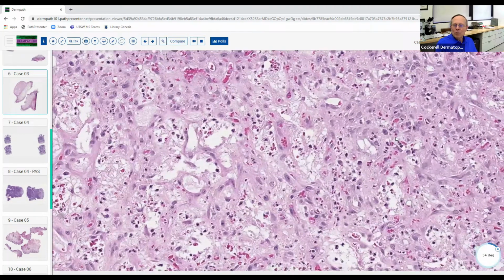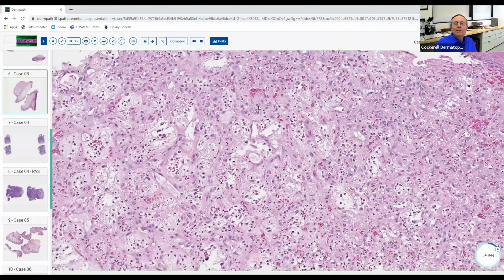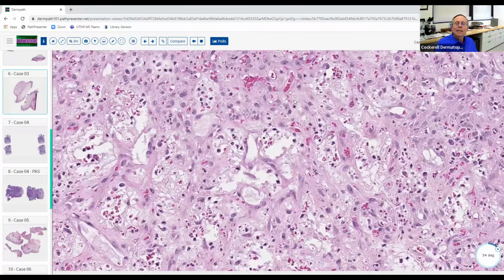They look very much like a pyogenic granuloma, but there's a little bit of distinction between them. They usually don't give you a suppurative neutrophilic infiltrate. It's usually maybe a little bit denser, but not a lot. There's a spectrum. Sometimes you can see some that really have more neutrophils than others, but if you can appreciate that fuzzy amorphous, pinkish material, you don't usually see that in a pyogenic granuloma, and that's helpful.